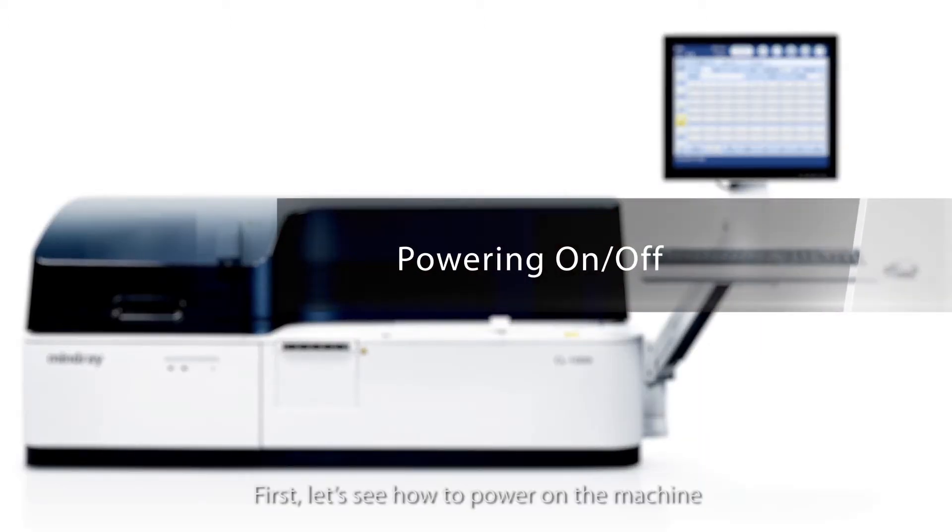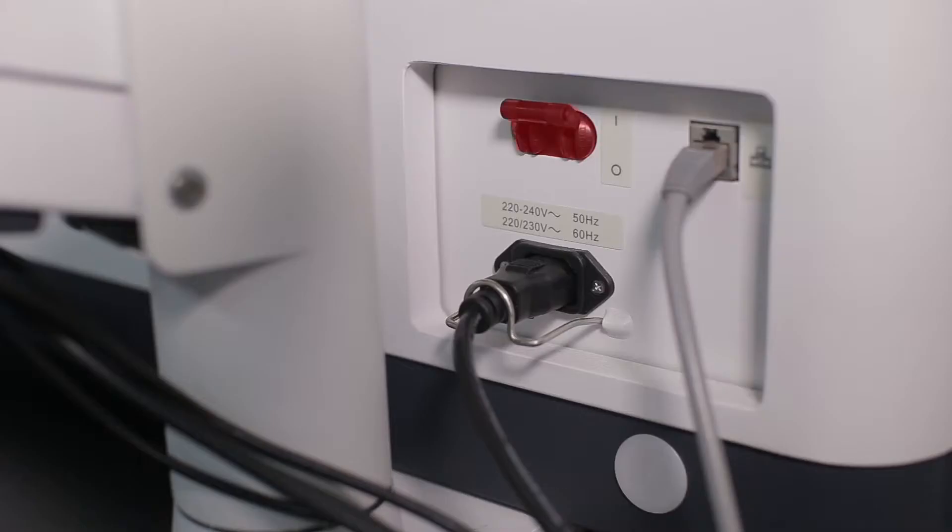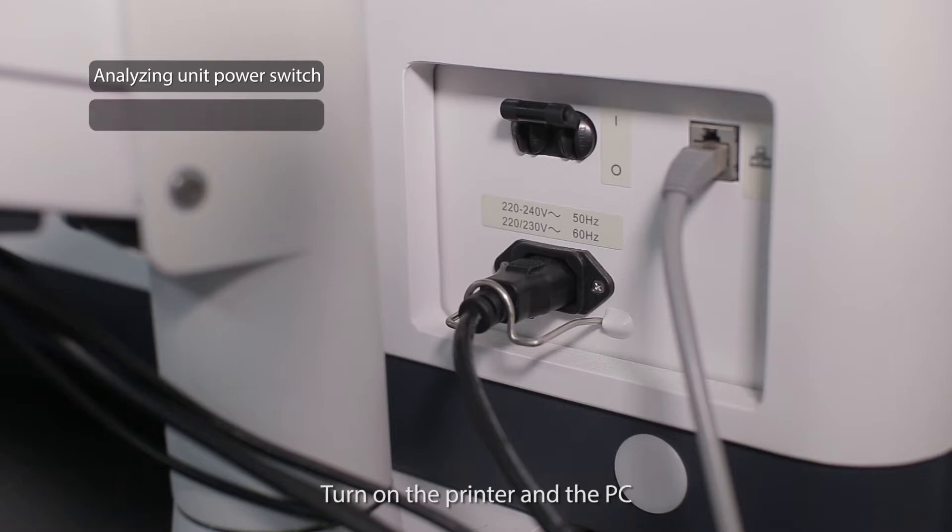First, let's see how to power on the machine. Turn on the analyzing unit power switch. Turn on the printer and the PC. Enter the operating software and log in.